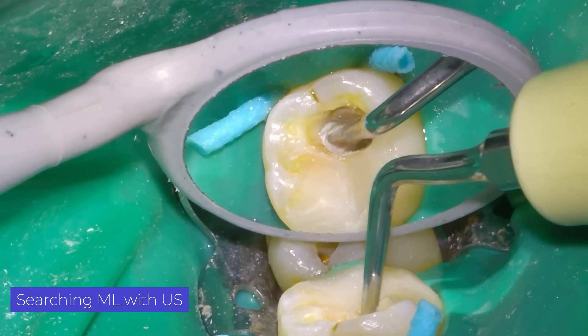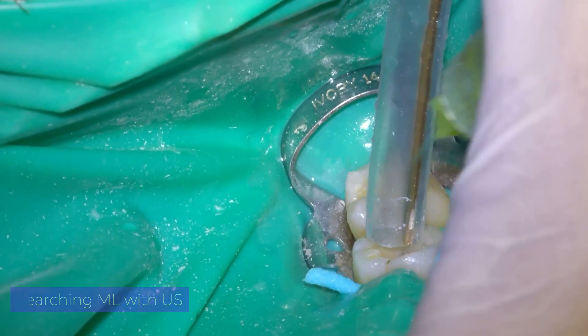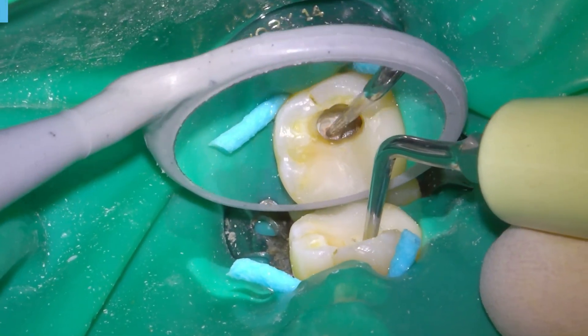We use ultrasonic tips to find the other root canal. This way we work slower and more precisely. Try to avoid high-speed drills so close to the furcation.